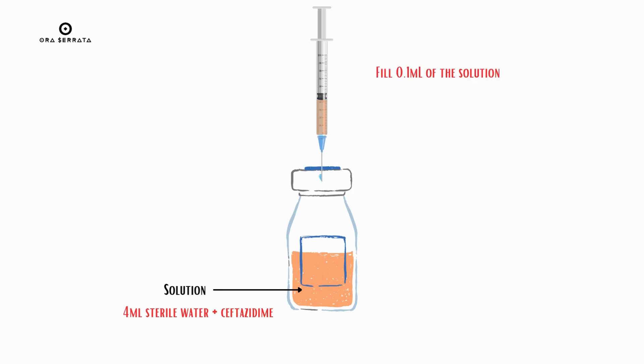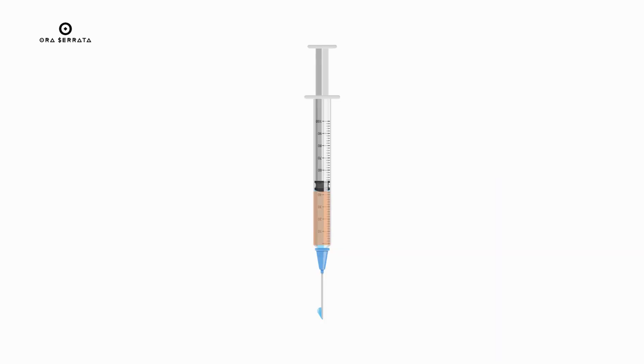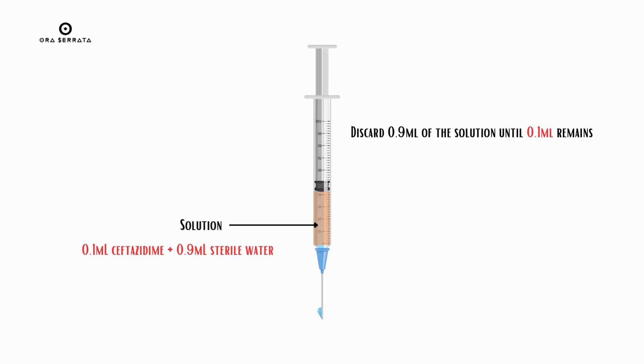Take 0.1 ml of this solution into a 1 ml syringe, then fill the remaining 0.9 ml with sterile water. Discard 0.9 ml of the solution until 0.1 ml remains — that is the final intravitreal ceftazidime dose.